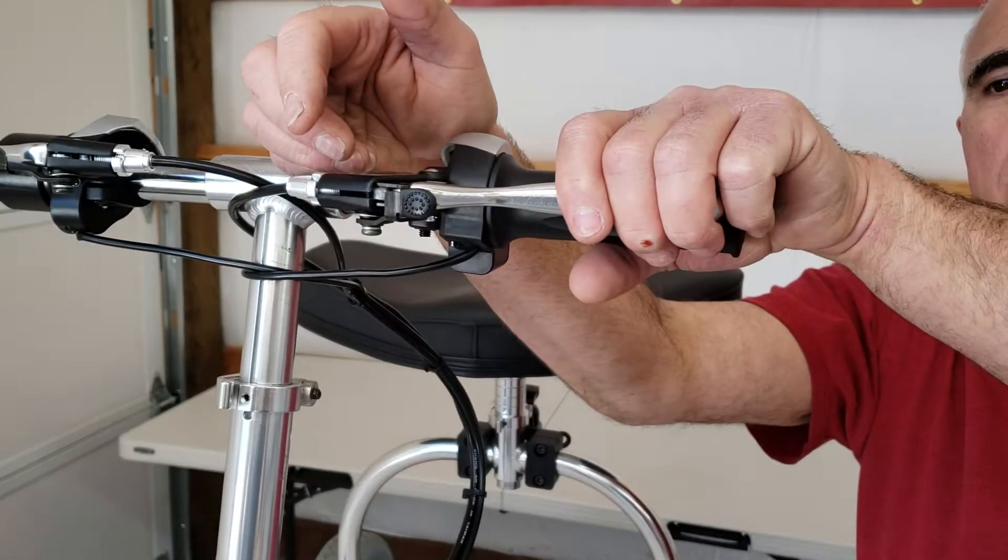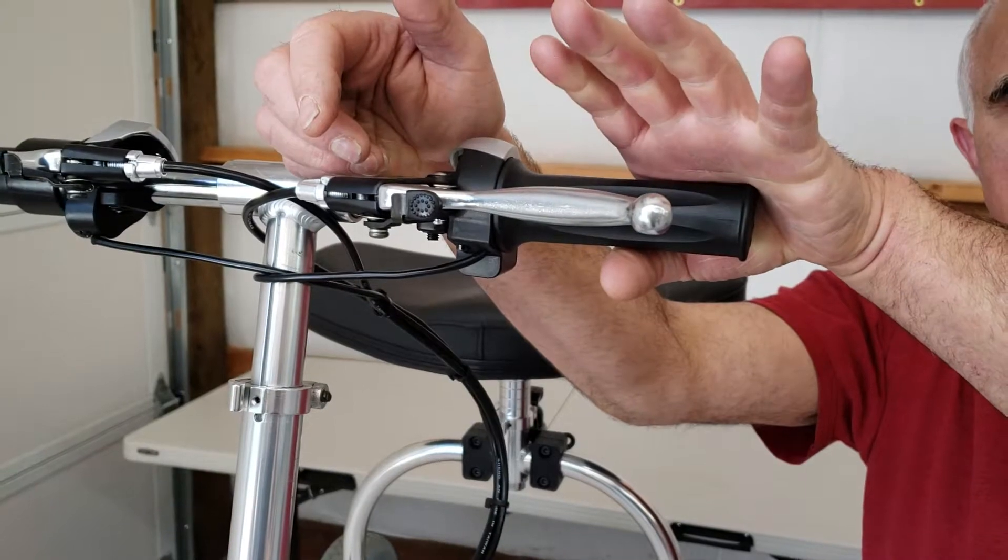To release the parking brake, squeeze the brake lever again, and they're off.